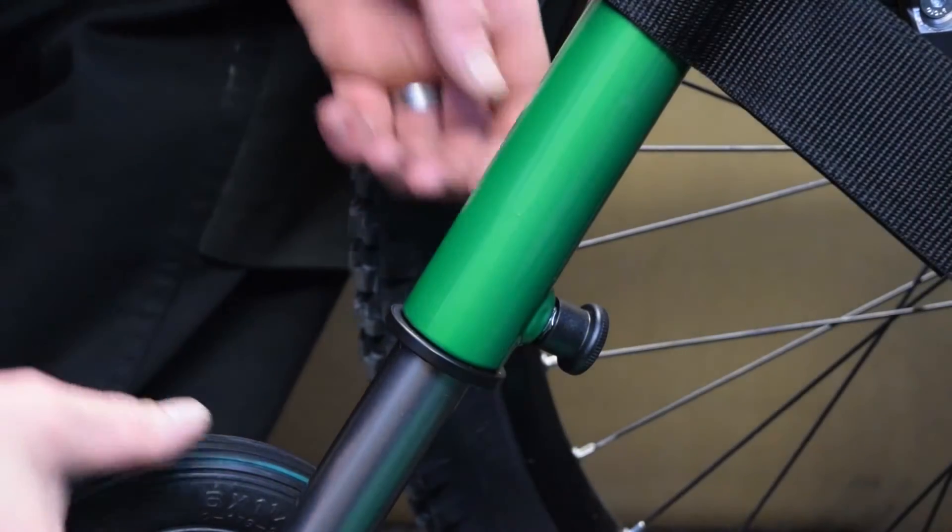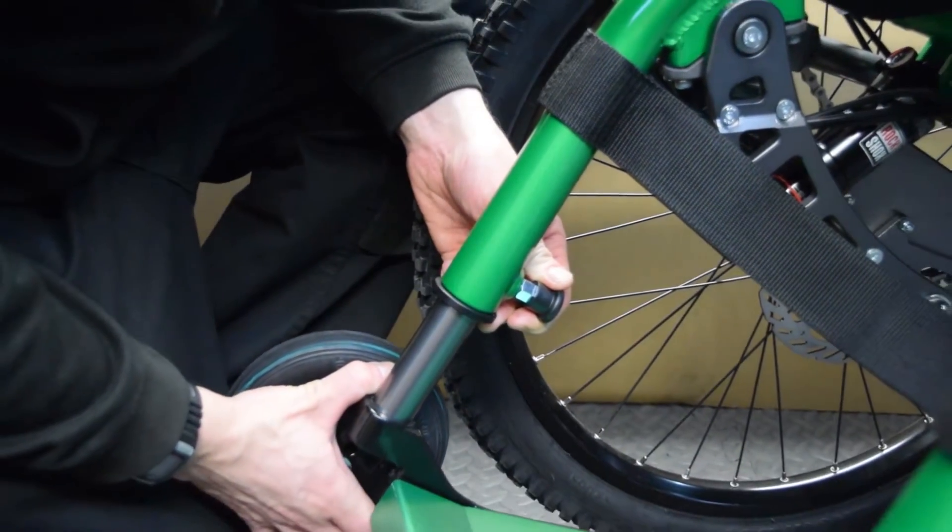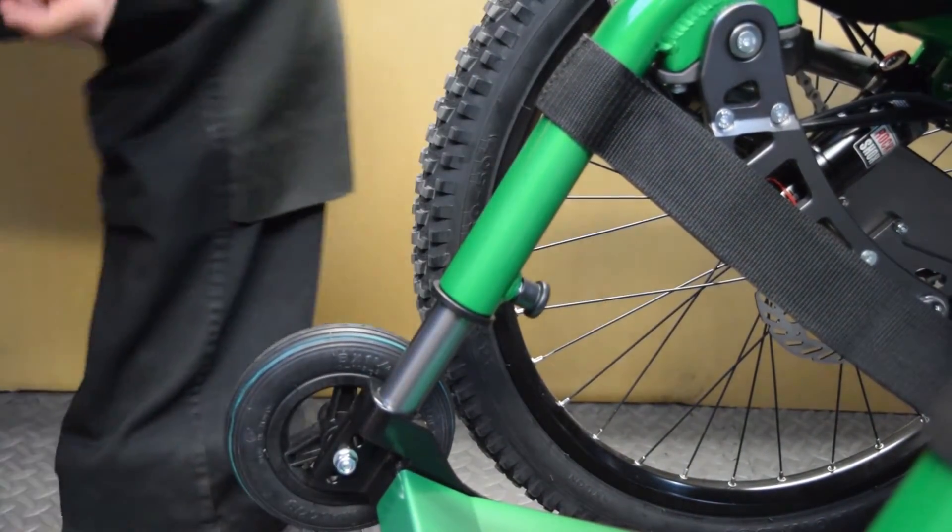To adjust the footrest height, pull the sprung latch outwards and slide the pillar up into the frame or down to suit your leg length.